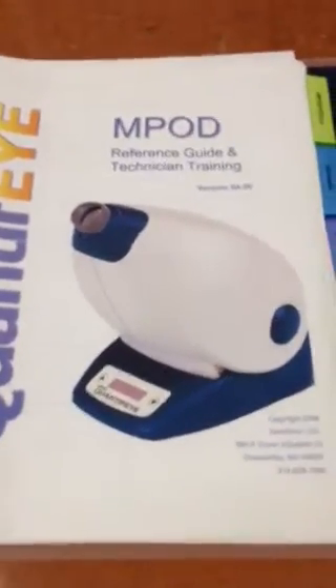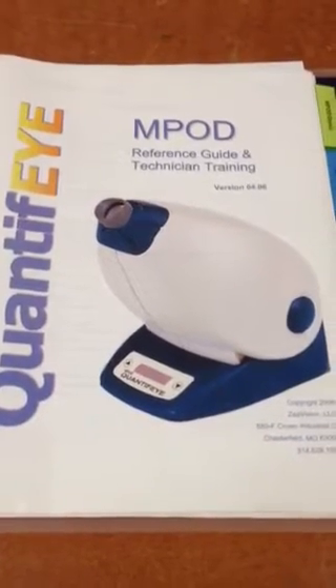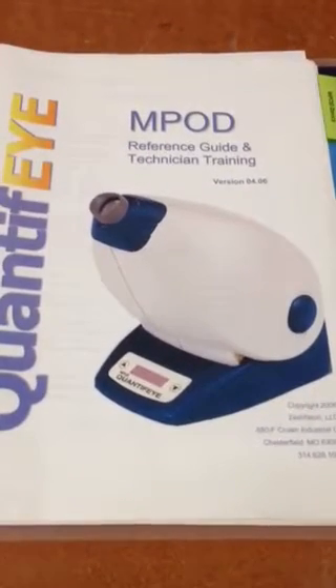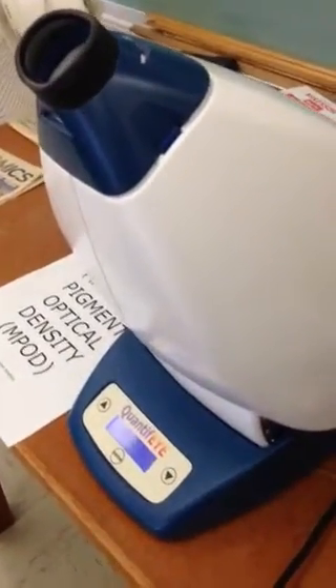Hello and welcome to a short video on the use of the macular pigment optical density tester, otherwise known as the M-POD. I'm Dr. James Kundart, associate professor at Pacific University College of Optometry, and I would like to show this video to my students in particular for use of this instrument in the demonstration mode, as I originally learned it in an exhibit hall for the American Academy of Optometry.